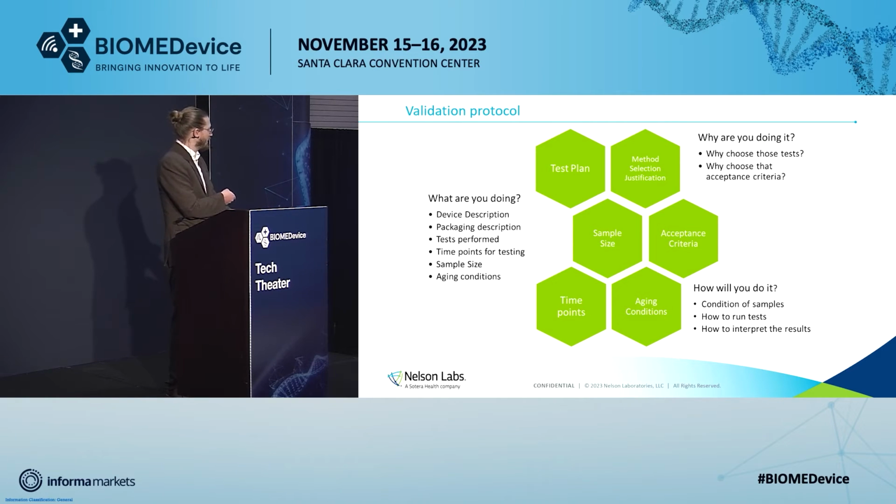You need to include what your device is and what your packaging is. You need to include your time points for testing. We're not just doing baseline testing, right? We've got to get some shelf life data out there, so you've got to know how far out you're going to be testing. Sample size and aging conditions. Aging conditions is not just that we're going to age it, right? But at what temperature are you aging it? What's your ambient storage temperature? How long does it need to sit in the chamber to hit that shelf life?